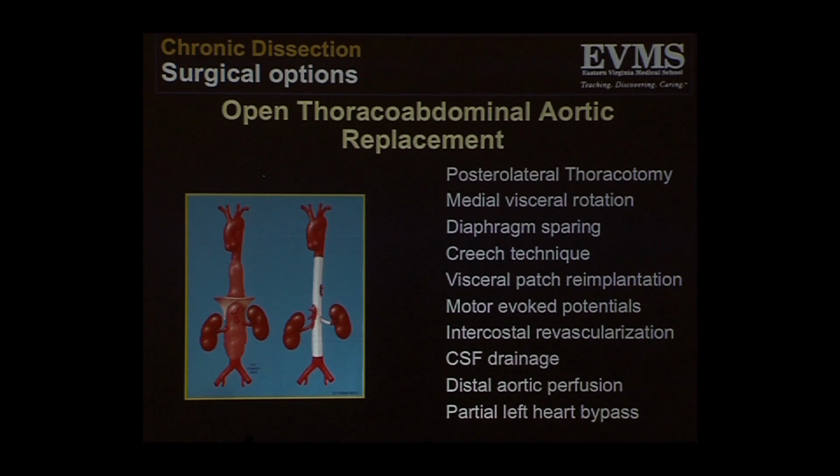We do selective intercostal revascularization. We use CSF drainage routinely. We will use distal aortic perfusion and partial left heart bypass in selective patients.